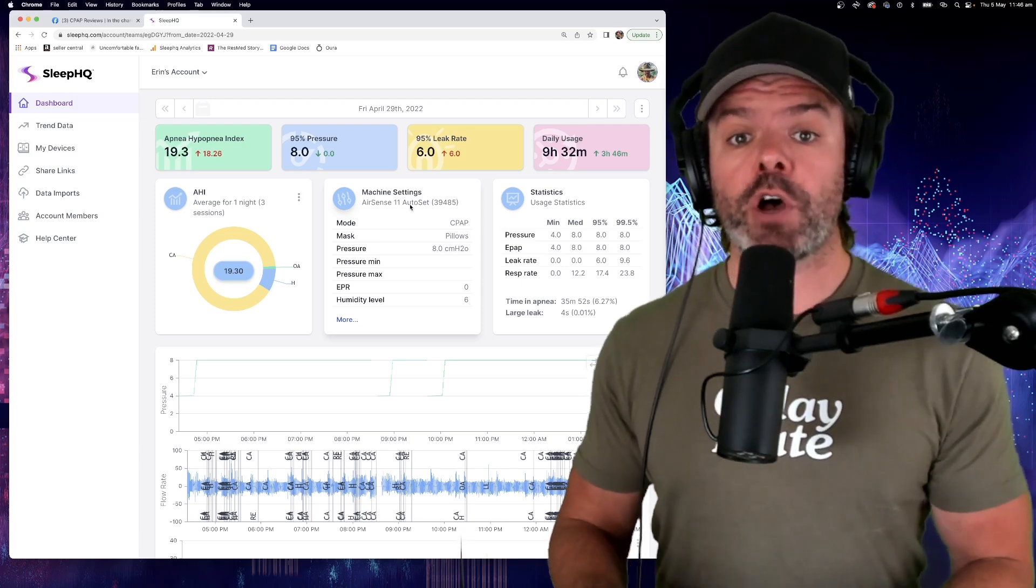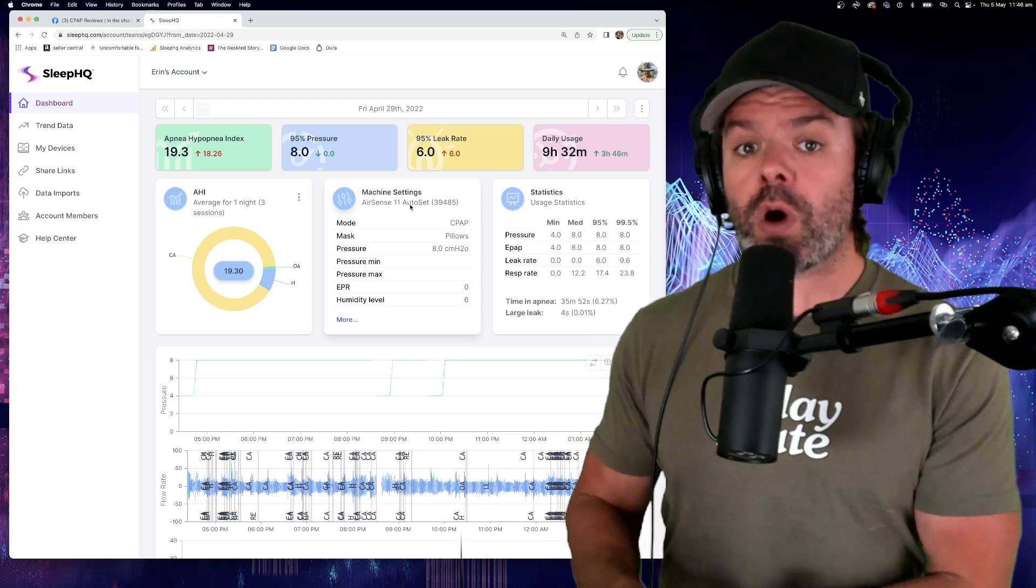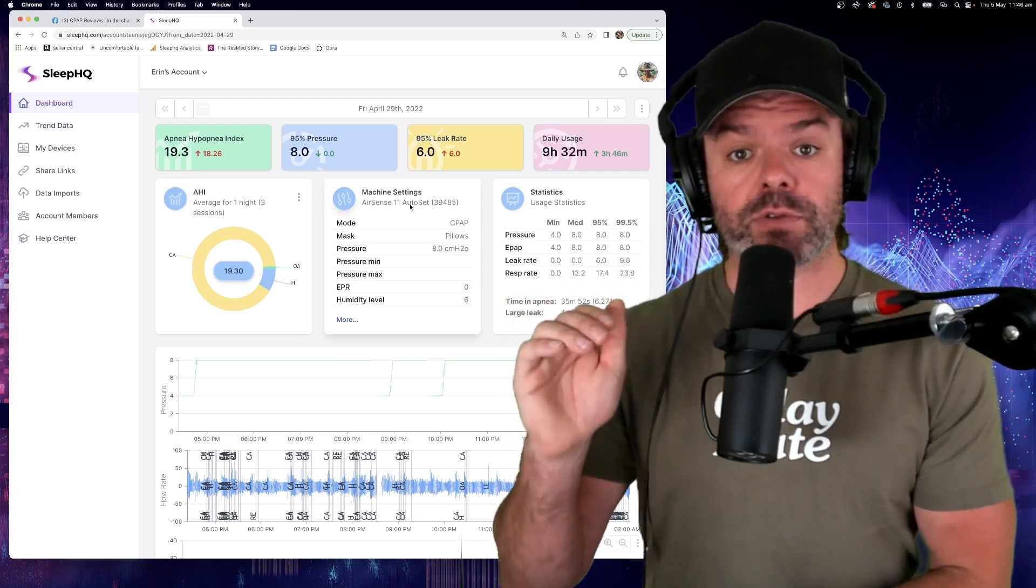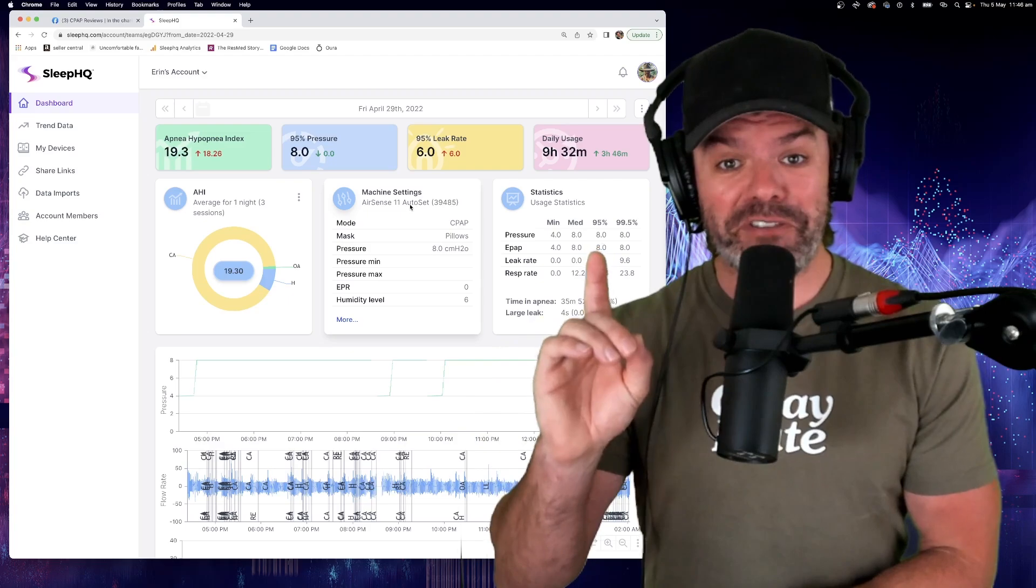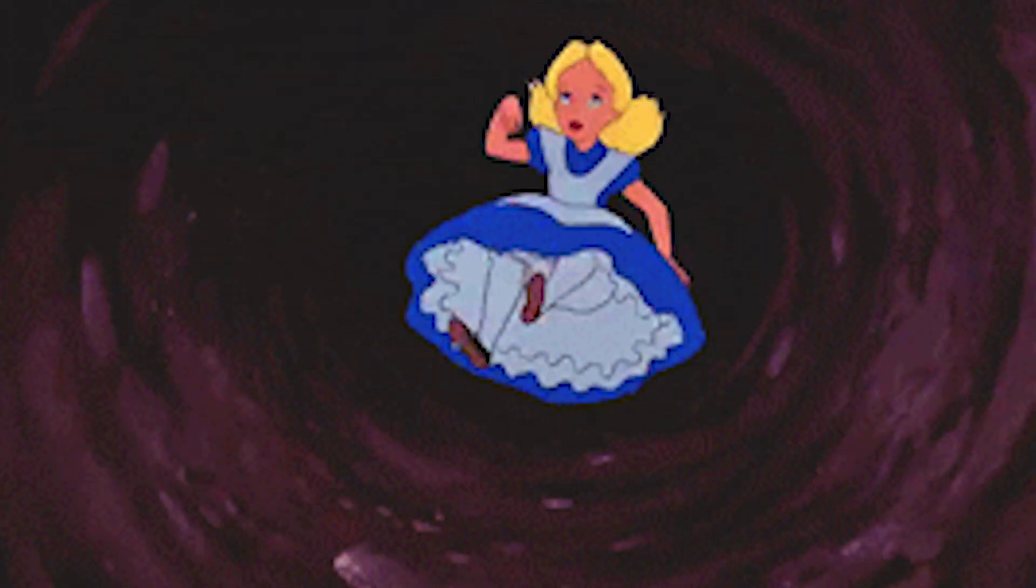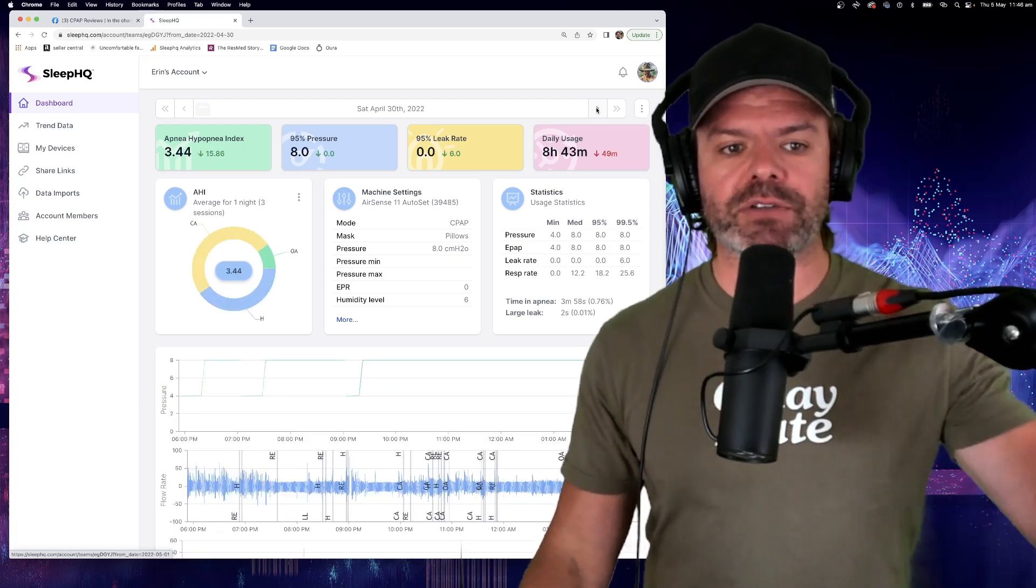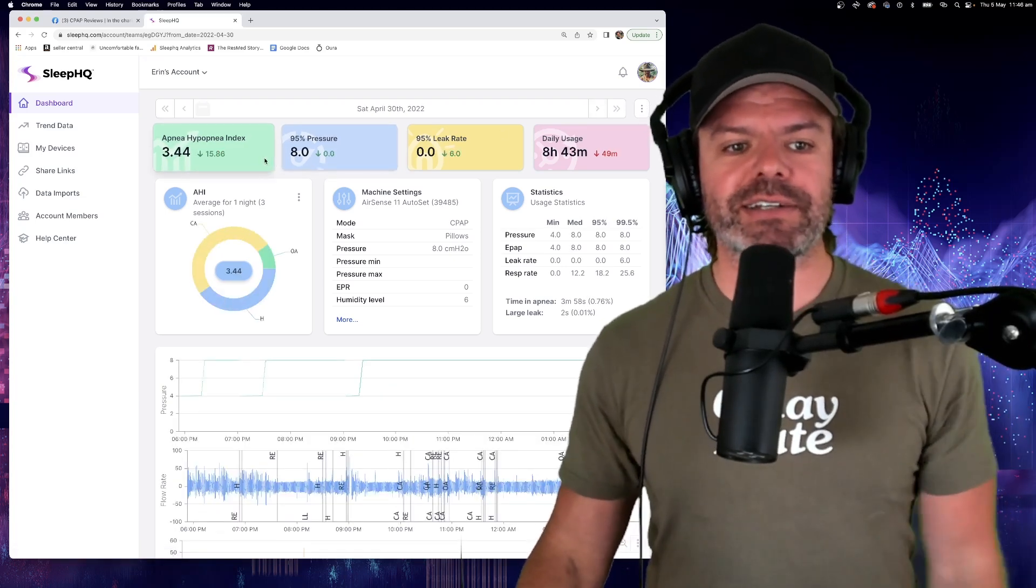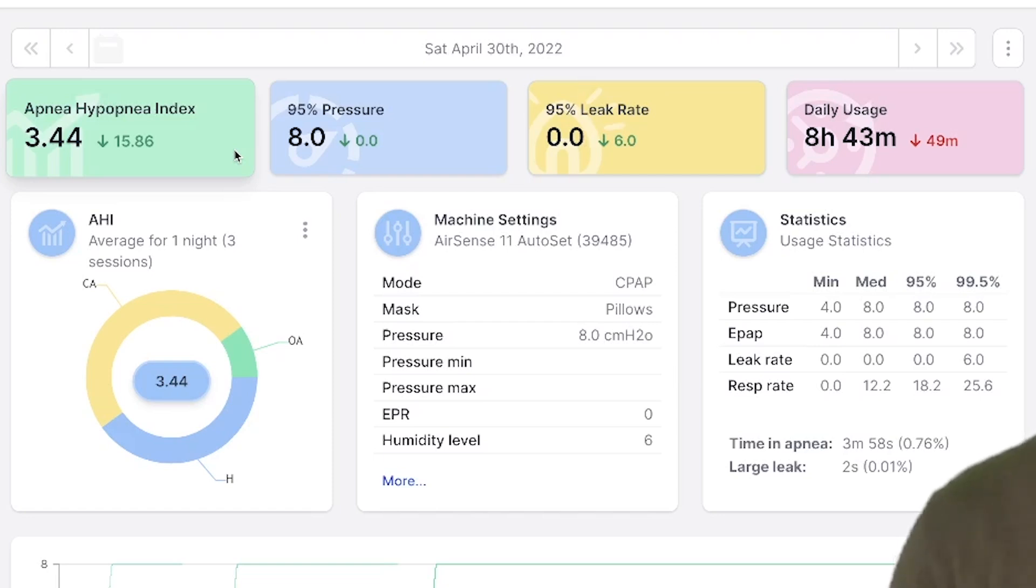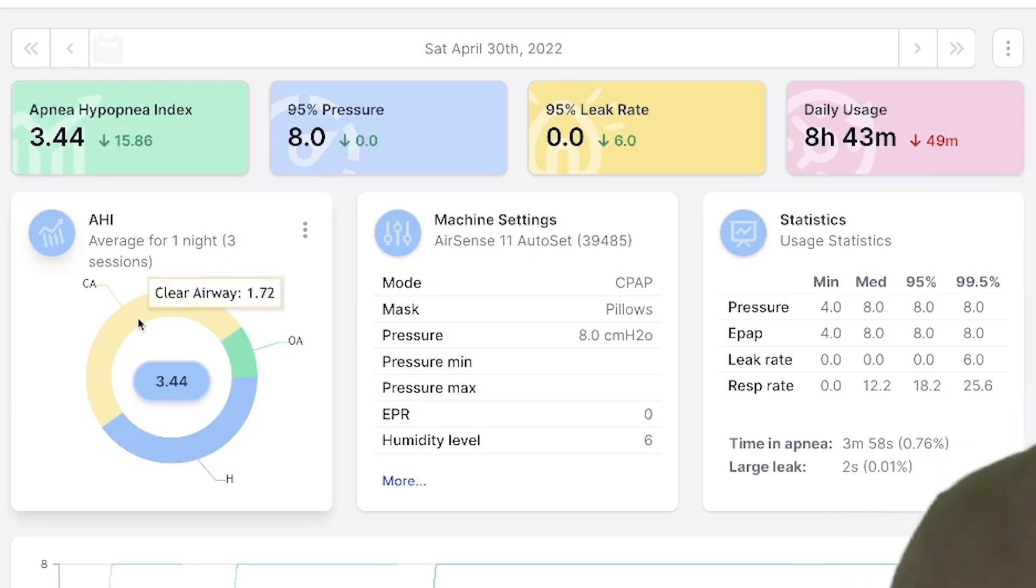And studies have shown that for some patients, moving to a higher altitude can induce central sleep apnea. However, the rabbit hole continues. If we move forward a couple of days, she's still in Denver. She's still at that high altitude. And now look, the next day, her AHI is down 15.86. Once again, under five at 3.44. And our central apneas are only 1.72.